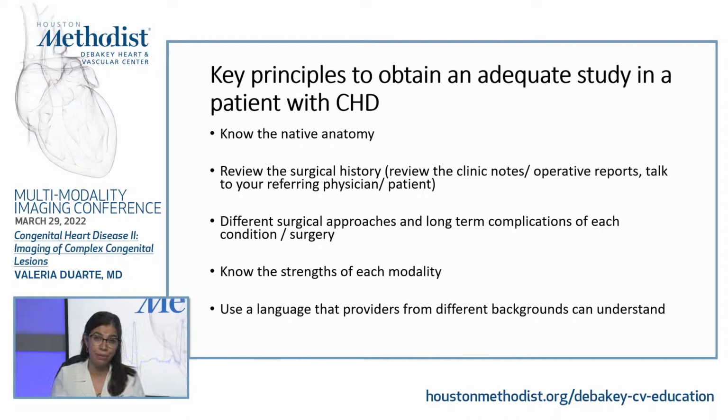And we need to know the strengths of each modality and sometimes know when it's important to complement different modalities to give a complete answer, especially for surgical planning, transplant planning, and so forth.